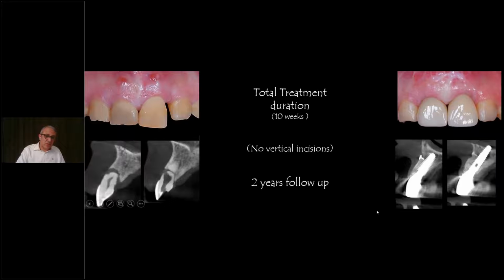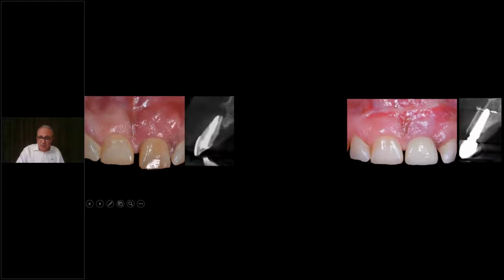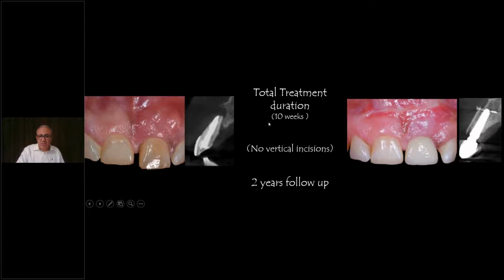Well, the same case that I showed you in the beginning when I asked what to do with a case like this, yes, we could reach up to doing this with no vertical incision, with immediate implant placement, with palatal regeneration, labial regeneration in 10 weeks' time with no vertical incision at 2 years follow-up.